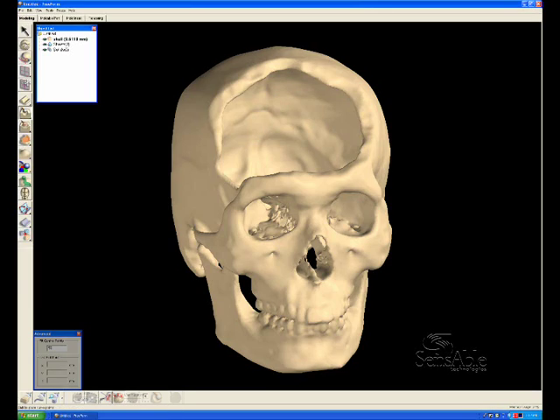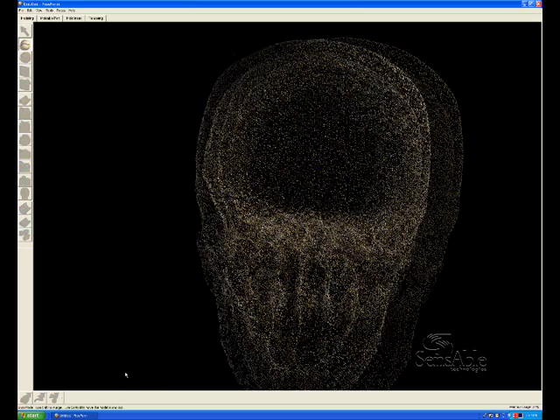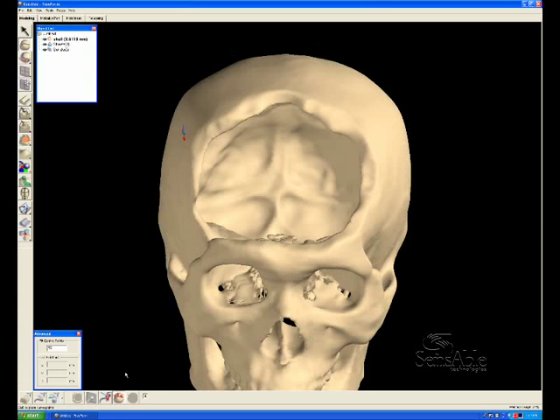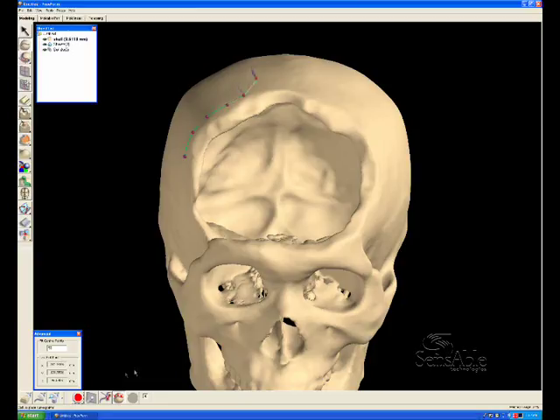In the following demonstration, Freeform Modeling Plus will be used to model a custom skull patch implant. CT data of a patient's skull was converted into an STL file. That STL file can be imported into Freeform Modeling Plus and converted into virtual clay.